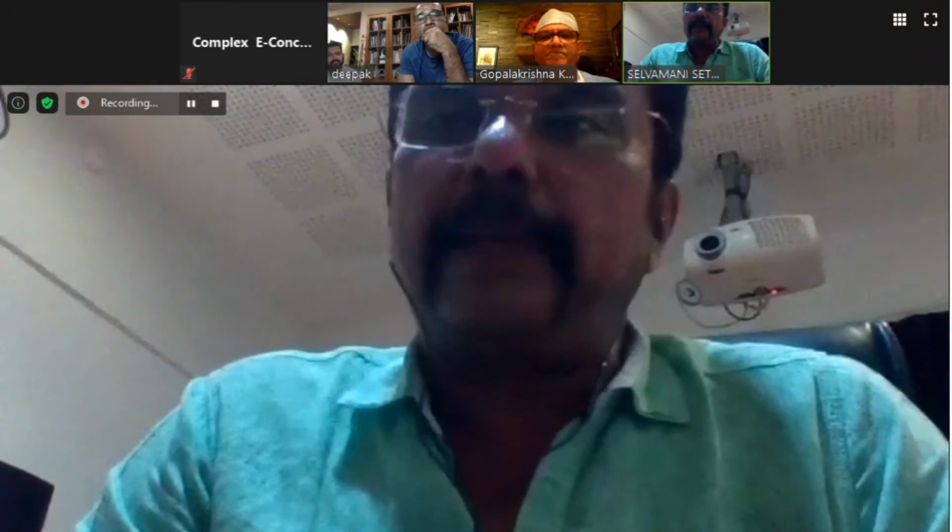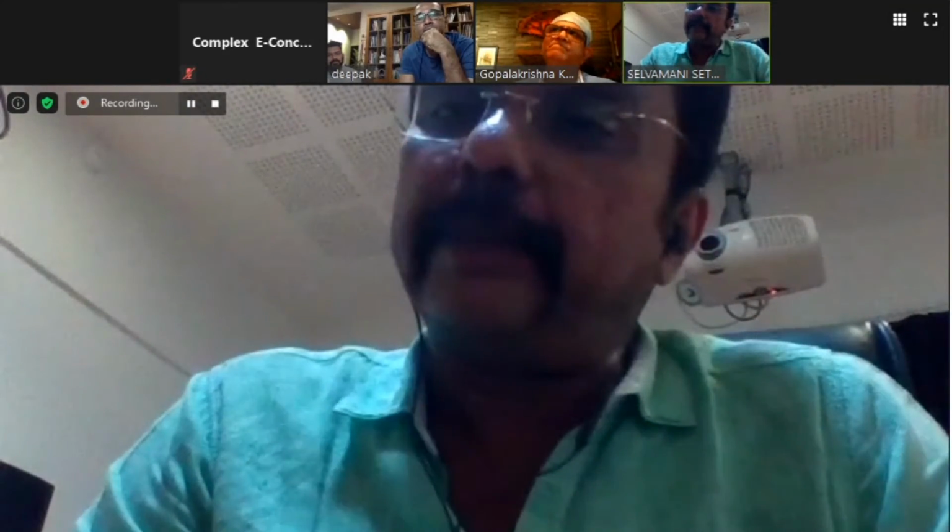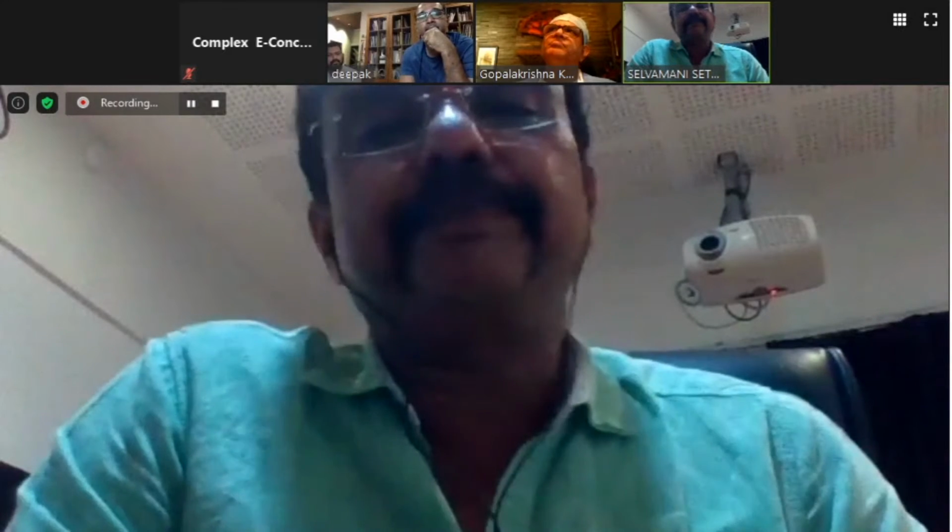So the next question is also from Dr. Krishna. First you will have to mark the EEL, and then once you get the EEL diameter, the machine automatically takes the lumen diameter.